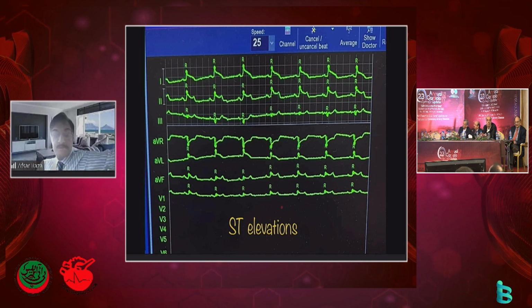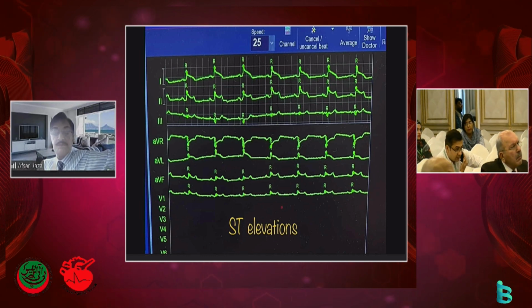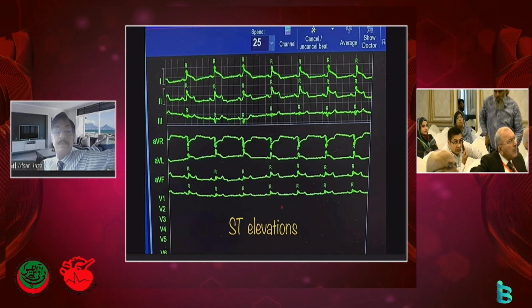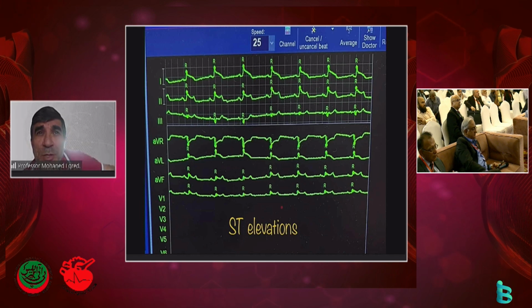I think, Sir, it can be a catheter-induced dissection of the left main. I would like to take the left guide immediately and take the picture of the left main. Yeah, that's one option, but the other is to take pictures and take the right shots also. Restudy this left system, see what happened. If it looks all right, then study the right. But the problem is that the patient is crashing down and we haven't manipulated anything with the right coronary artery.